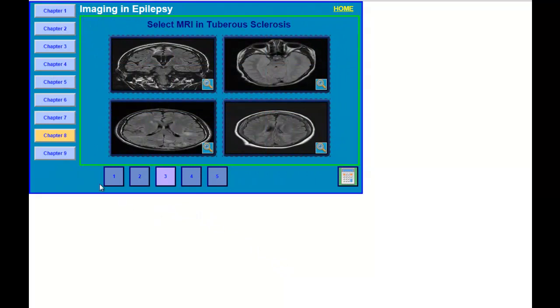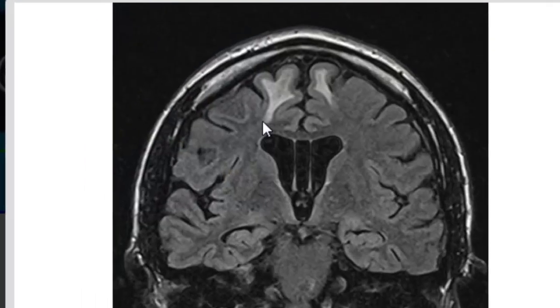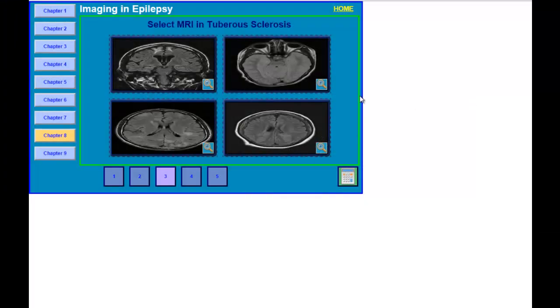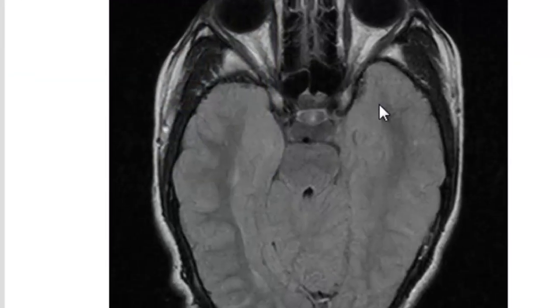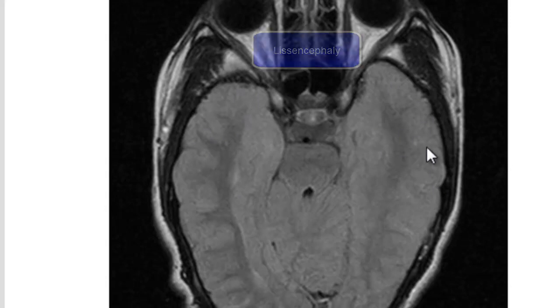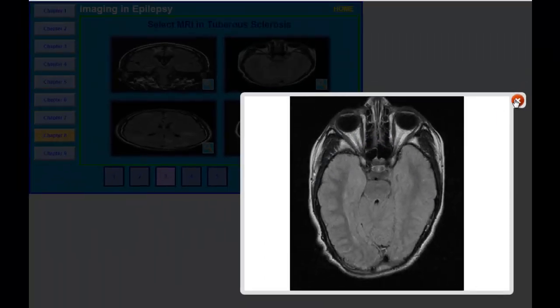The next question is to select an MRI in tuberous sclerosis. In this first image, you see increased signal in the white matter in the frontal regions — this is typically seen in patients with traumatic head injury, so this is not tuberous sclerosis. In the next image, you see flattening of the gyri — this is lissencephaly — and there are areas of dysplasia on both the right and left hemisphere, so this is also not typical of tuberous sclerosis.